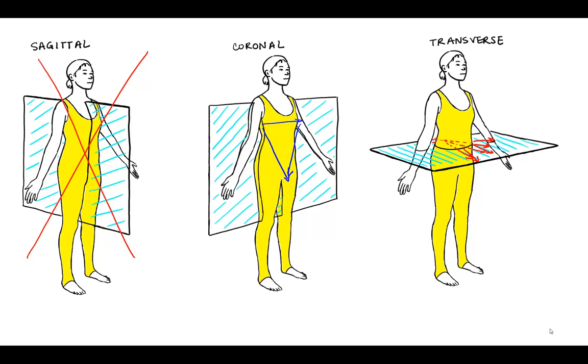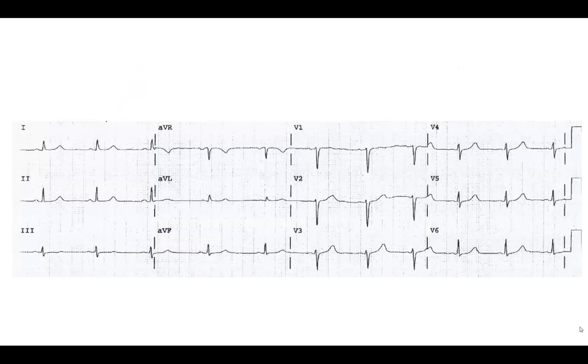So now what I'd like to do is go back to a diagram that I showed you way at the beginning of this presentation. It looks like this. And this is what an EKG tracing would look like if we got it directly from a patient. And remember that the textbook drawing of an EKG tracing looked like this. So what I'd like to do now is address the question that we started out with. How do we go from this simple textbook diagram of an EKG tracing, like here, and turn it into something like this, which comes from an actual patient?